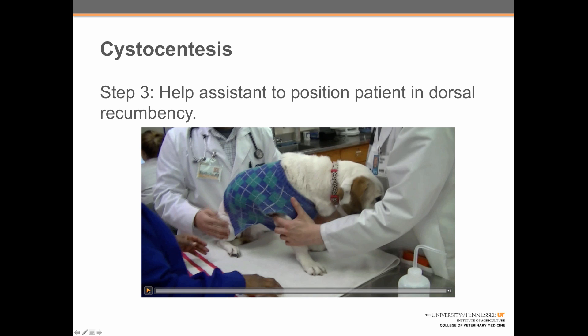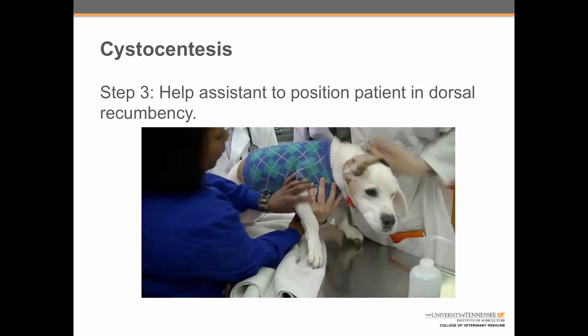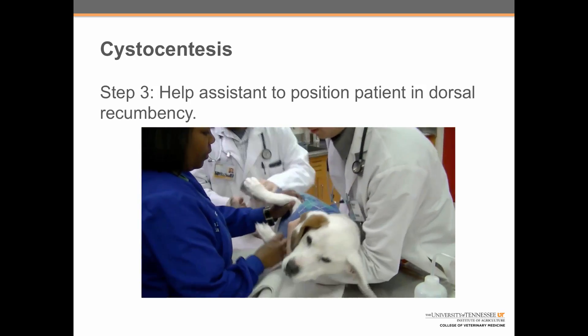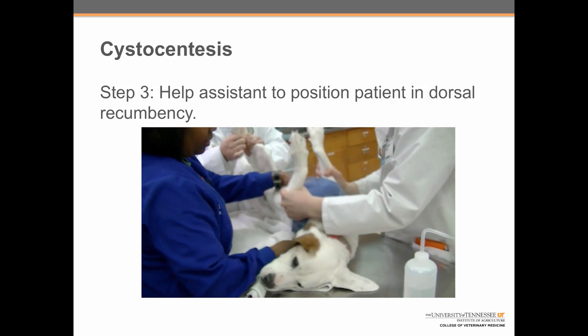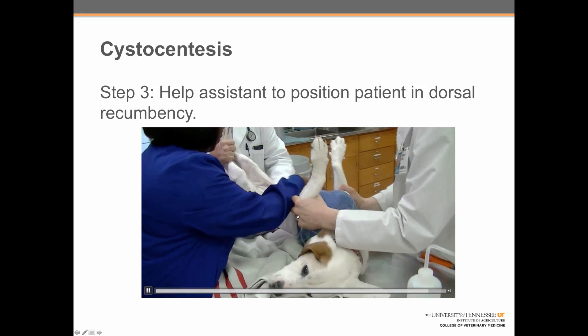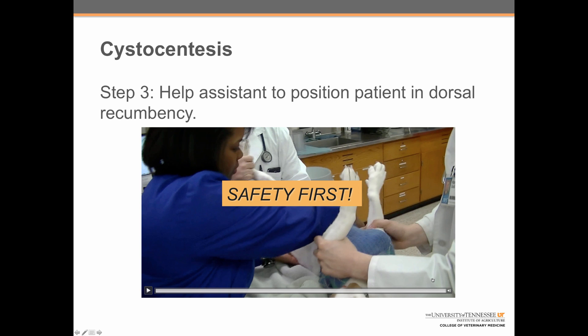Step three: help the assistant to position the patient in dorsal recumbency. Here we can see the assistants working together to move the dog's leg to one side to rotate her up onto her back. Note: the assistant on the front is holding his arm across the dog's neck to keep her from biting or jumping off the table. Remember, safety first.